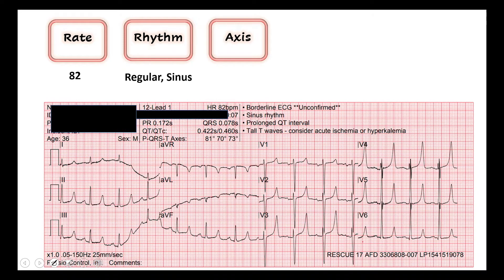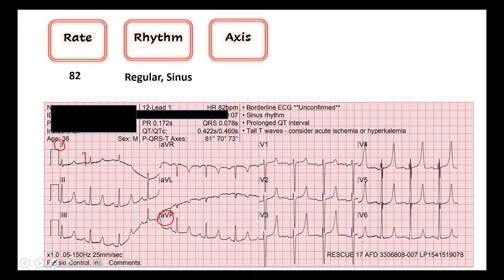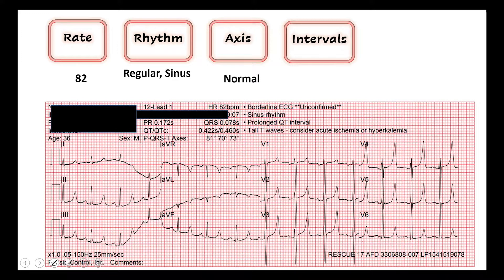Moving on to our axis — we always look at lead one and lead AVF. This is the way that the majority of the depolarization is going in the heart. In lead one, recall that you're using your left thumb to go with the majority of the QRS vector, and in lead one the majority of the QRS vector is up, so we have thumbs up in lead one. AVF, again looking at the majority of the QRS vector, AVF is up. We have two thumbs up — this is a normal axis, which is also very reassuring.